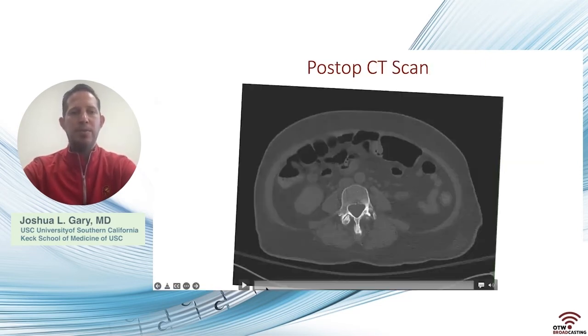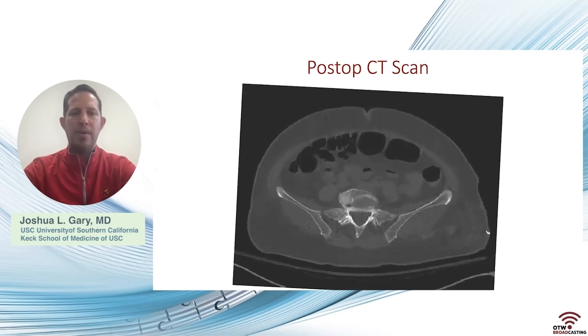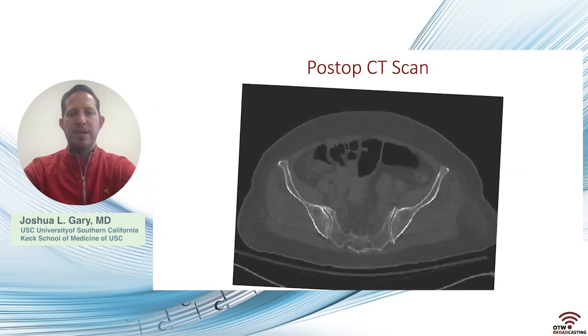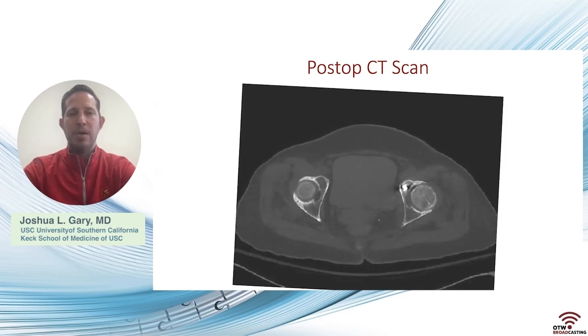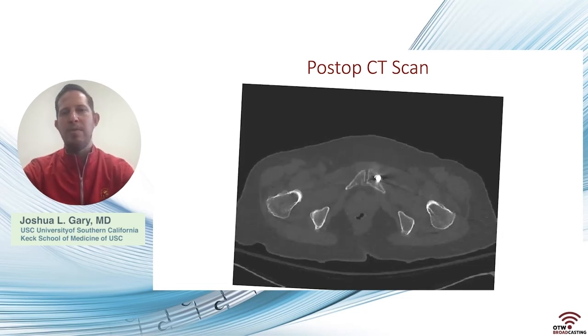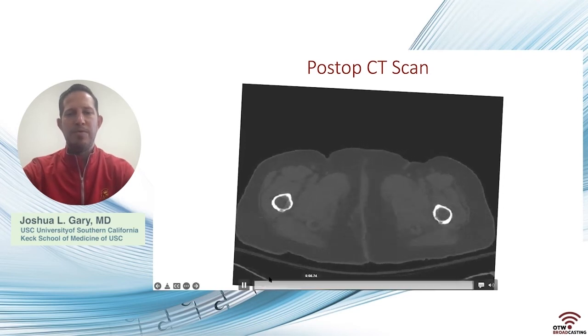And so here is her postoperative CT scan. And you'll see on the images here, we were able to navigate this corridor with the rod screw and CurvaFix. And she was neurovascularly intact postoperatively with no issues. And then we had a screw up front. So really, really pleased with the surgical result here and what we were able to do that we wouldn't have been able to do before.